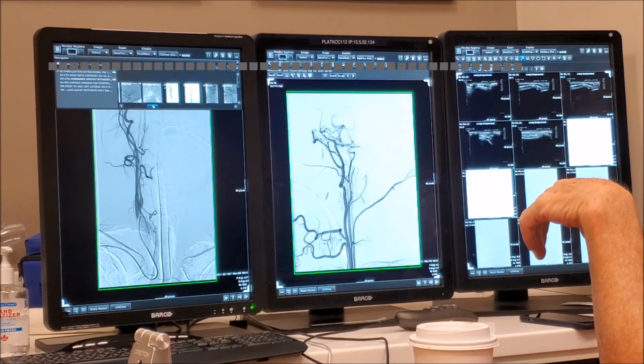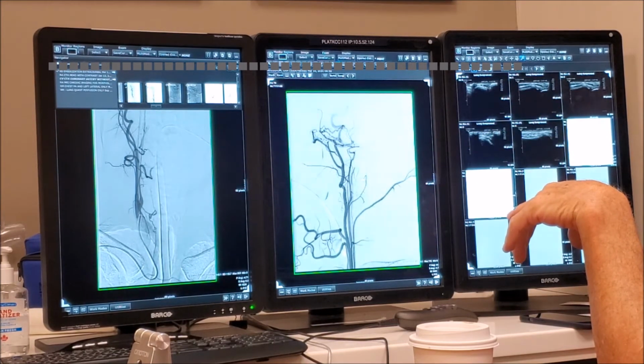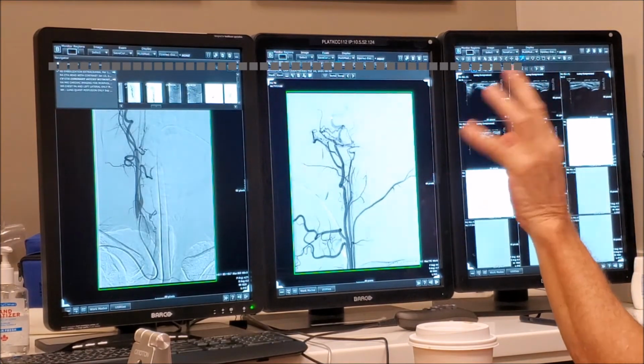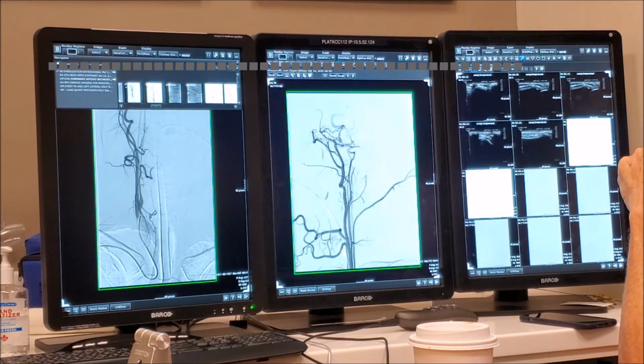You didn't get a shallow shot, huh? Oh, this would have been a beautiful one. Okay, so now we have an interesting phenomenon here. Okay, Christina, I'm after you this time. What is this structure? That structure is the ICA. Okay, not physiologic, but not real physiologic. How did it feel?